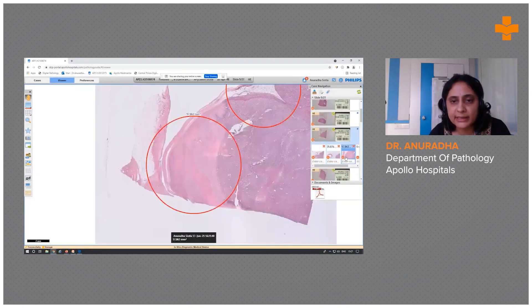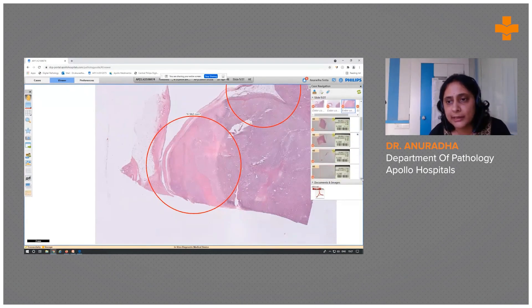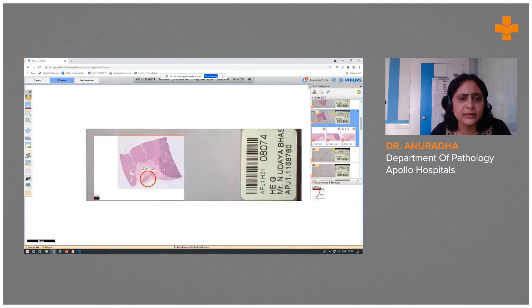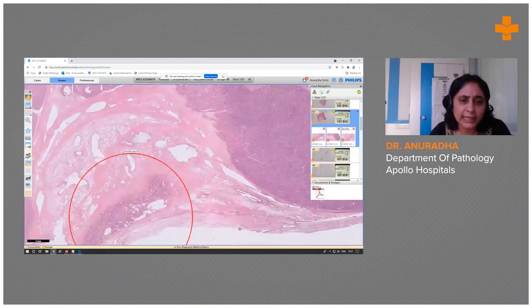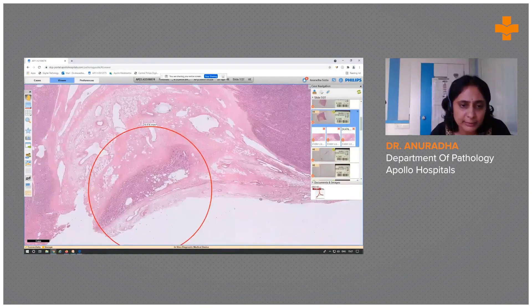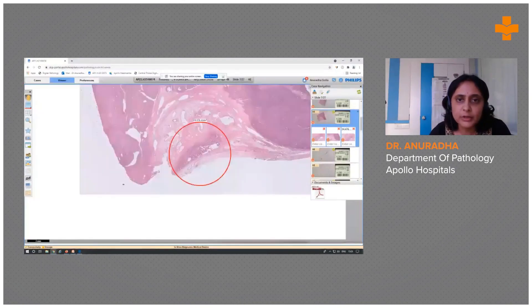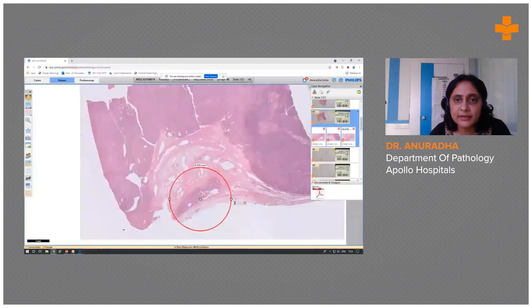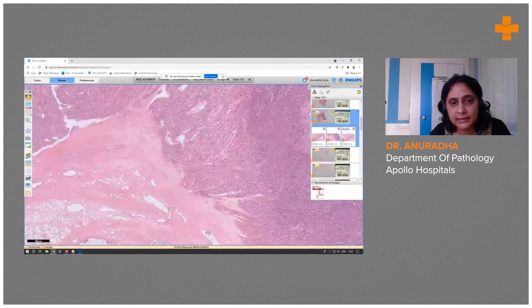It is a very highly cellular tumor with areas of necrosis. There was a thin sliver of adrenal seen in the periphery grossly, and it was free of tumor. Microscopically, the adrenal looks free of tumor, but the tumor is infiltrating into the perinephric sinus in an irregular pattern.